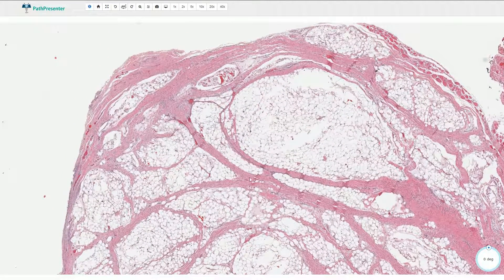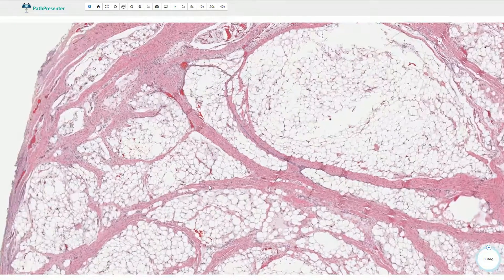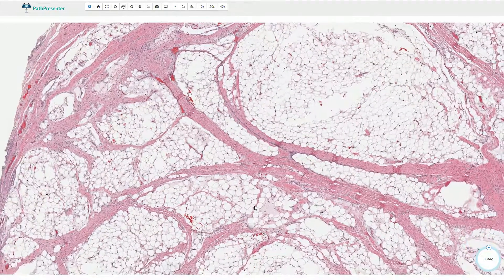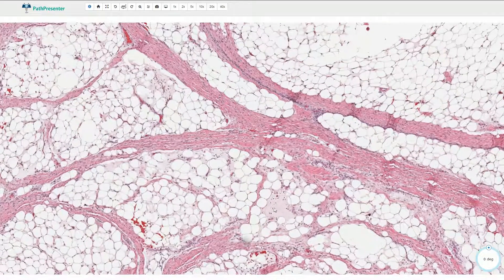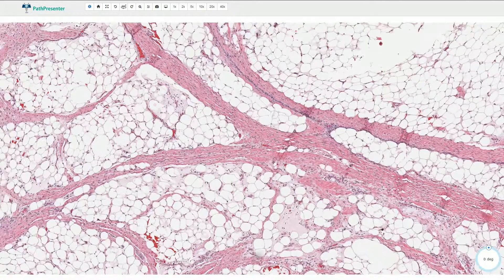The lobules are also quite irregular — some of them are larger, some of them smaller — and the lobules are composed of adipose cells in different stages of development. We can see the normal mature adipocytes and also these mesenchymal areas of loose myxoid appearance.